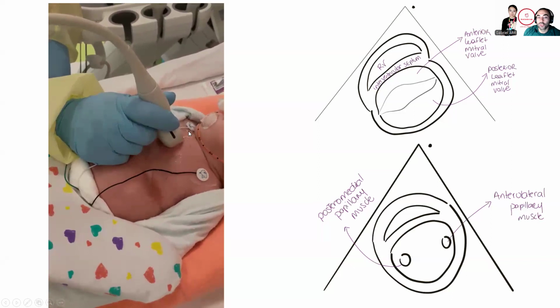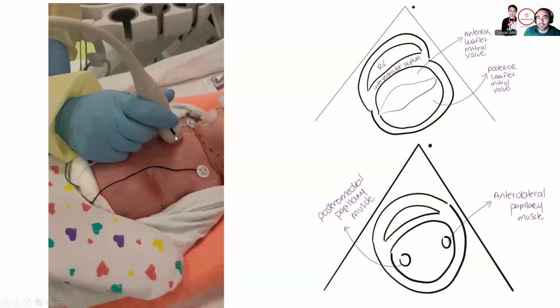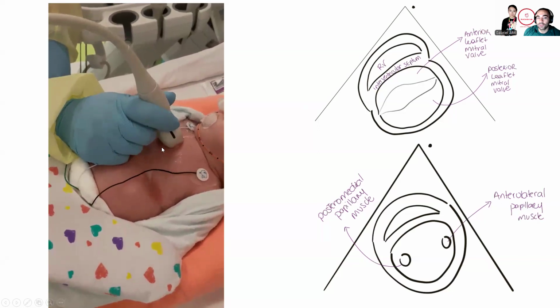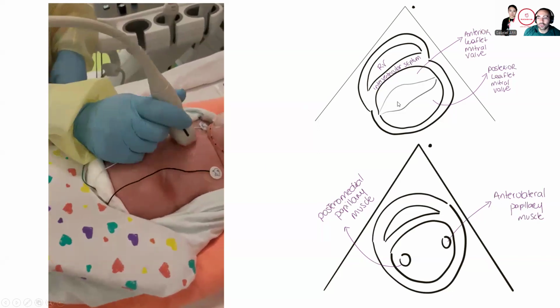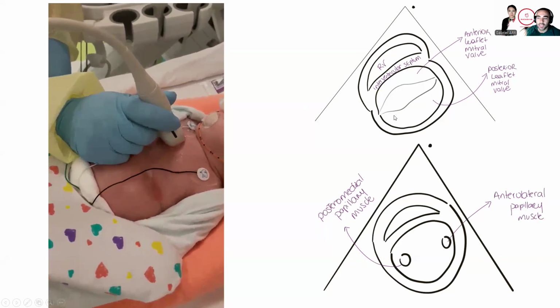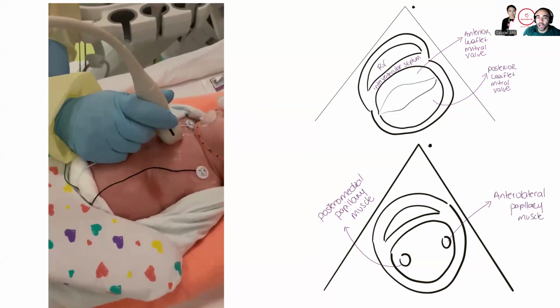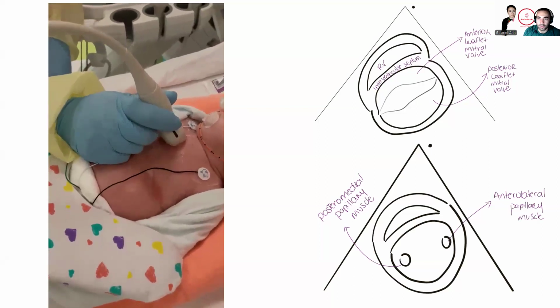It's almost close to the suprasternal area, because I see a lot of people going very close to the nipple line, and you just don't get a short axis, or you'll falsely get what you think is a short axis with septal flattening. It's actually because you're too low on the chest and you're not getting the perfect image.